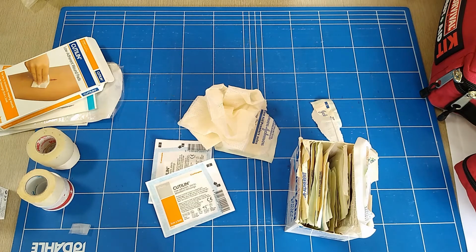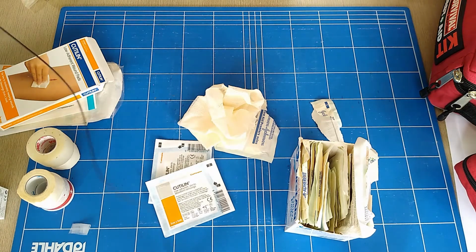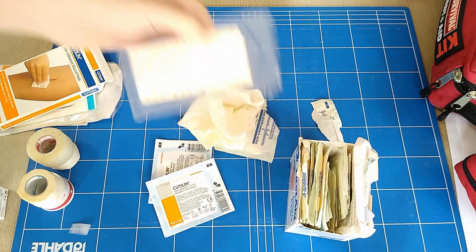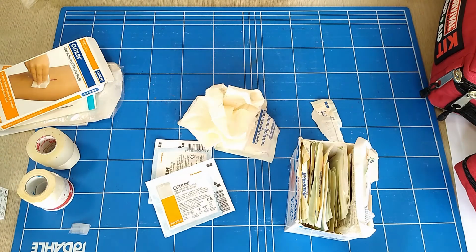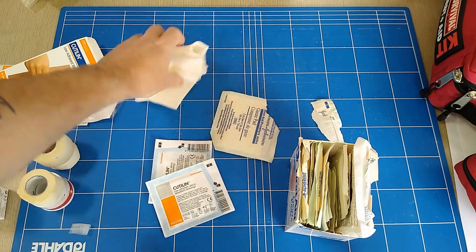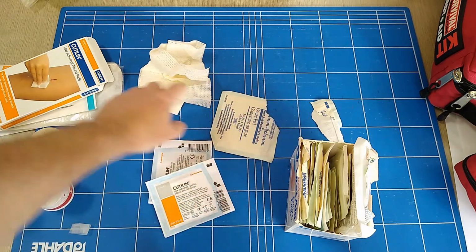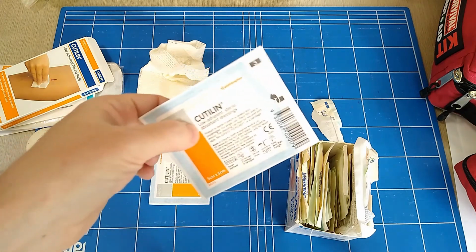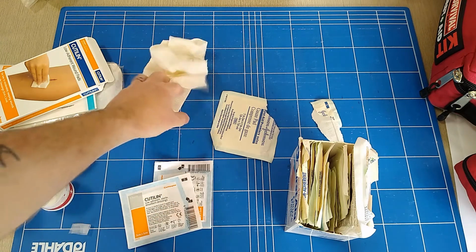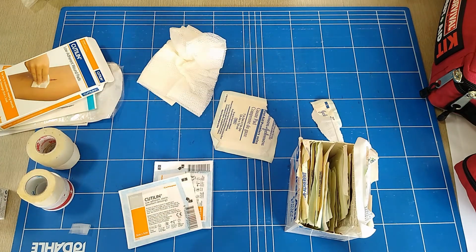That's where you will get into things like Steri-Strips, stuff like that. They can be super handy. They do take a bit of a technique to use. But the main thing is, don't spend money on sterile gauze. Spend money on low adherent stuff, and then just buy cheap gauze.